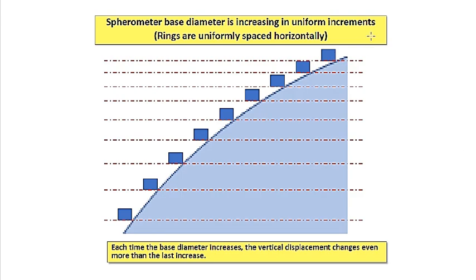So your tip of the lens curvature is right there. If your base is here, then of course that displacement changes. So your lens tip is right there. So with the small base, the displacement is only that much. Now your lens tip is right here. Next larger base, your displacement goes larger and larger, and so on.